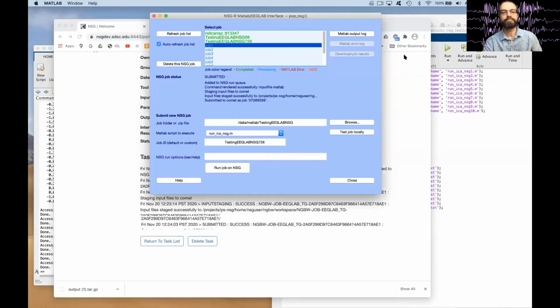Arno, there are a couple of questions. Maybe I will read off from the question box. One question was pretty early, one of your slides, when you showed the two matrices, I think after doing ASR, good data versus bad data. So the question is, bad data versus good data. Good data would always look like the one shown in slides by Arno, regardless of any experimental conditions.